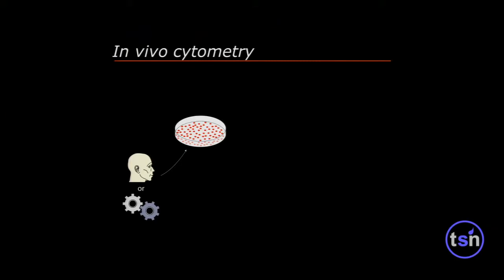They can be any types of cells, autologous, allogenic cells, or engineered cell line. We've been developing these things called perfluorocarbon emulsions. Perfluorocarbon molecules, I'll show you a picture of one, have been studied in biomedicine for many decades in the context of artificial blood substitutes. Dwayne Roth's name was mentioned. Alliance Pharmaceuticals is the prime example of research endeavors in that area.